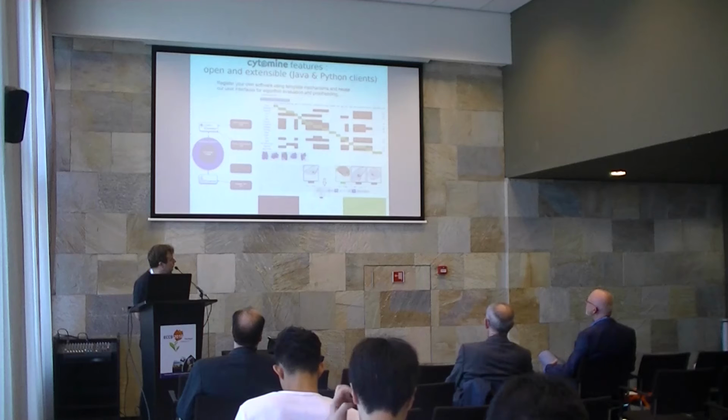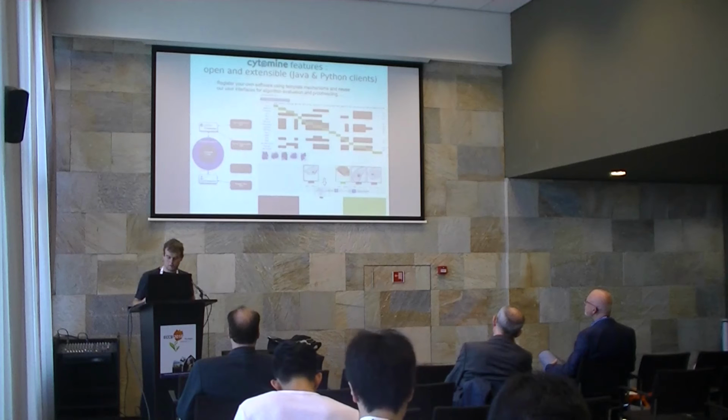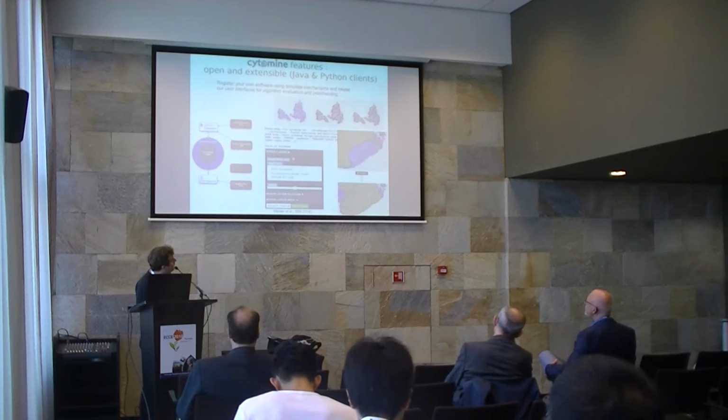And we also have a proofreading interface, so that if your algorithm is not correctly classifying objects, you can drag and drop and correct this classification using the user interface. All these user interfaces are not linked to a specific software, they are generic, so you can reuse them, and that's the same here if you have an algorithm that generates segmentation masks. Like in this application we worked on, the goal is to segment tumors. You can imagine plugging in your own segmentation algorithm using some code, and then it will appear directly in the user interface.